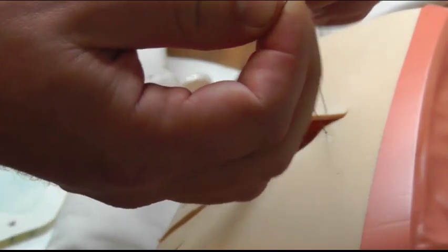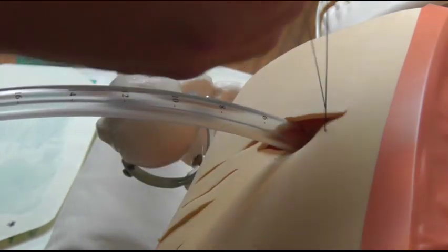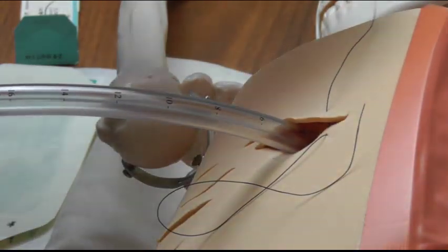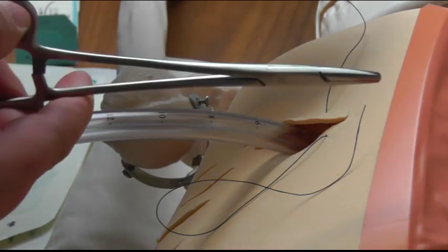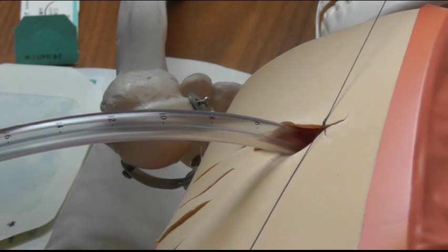What you can then do, it's up to you, if you're good with your surgical knots, you can tie a surgical knot, or if you're not, just do your standard ED thing. If you're not confident with that, grab your needle holders and just do a normal stitch.